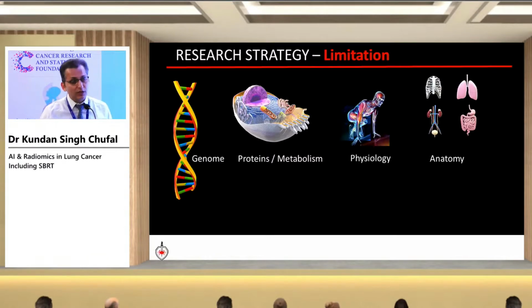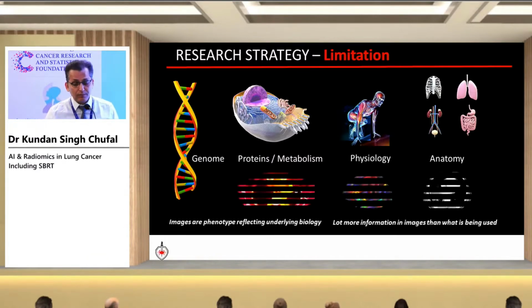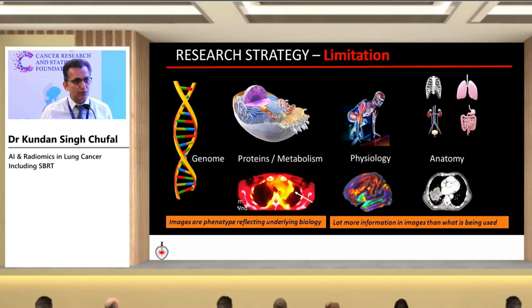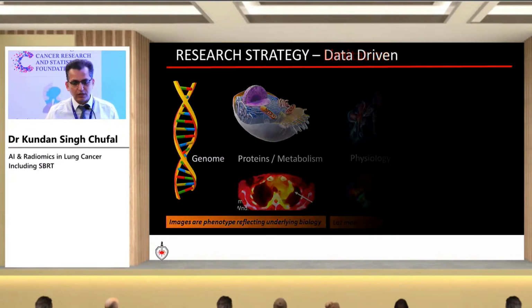because when we are talking about clinical data as well as imaging data, we have a huge amount of data which we can generate from these medical images. And to follow this conventional approach is not the right approach in this particular scenario, because we can't actually do all kinds of statistical analysis in these scenarios.